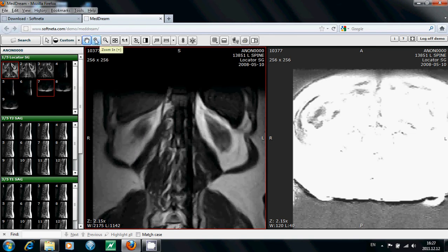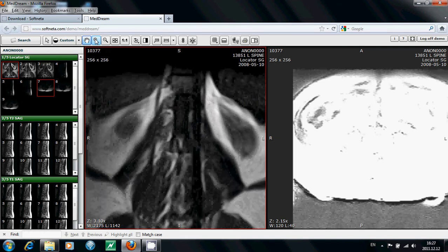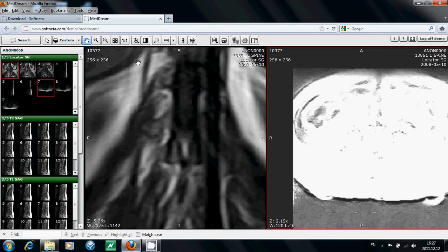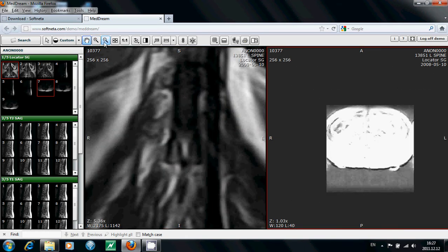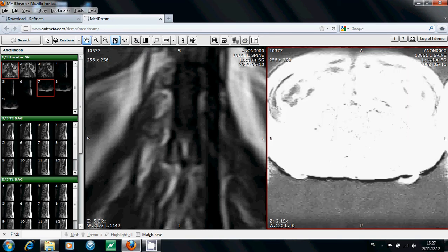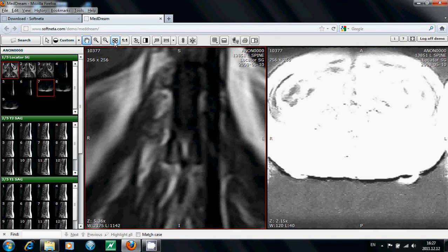Zoom In button increases the size of the image. And Zoom Out decreases it. After pushing Fit to Screen button, the size of the image is automatically adjusted so that the image would fill the entire screen.